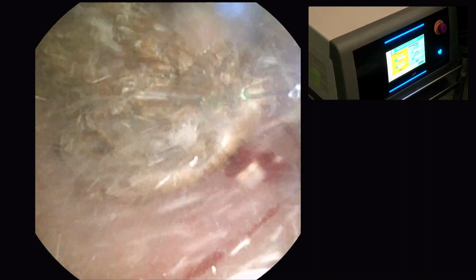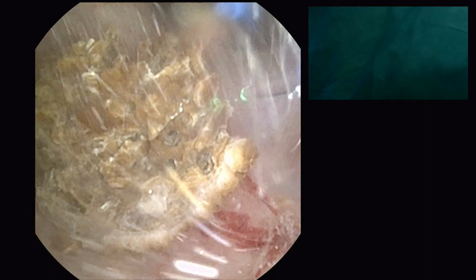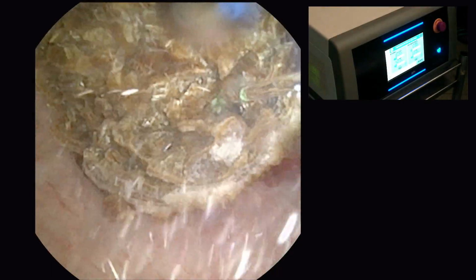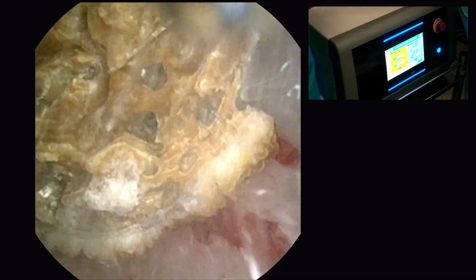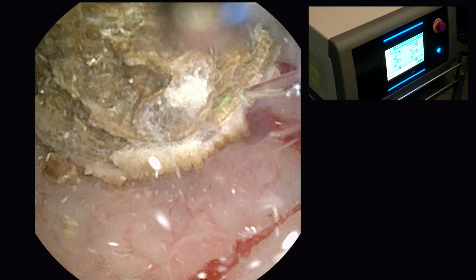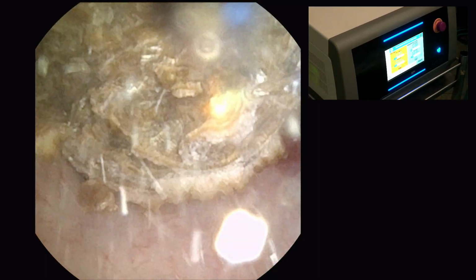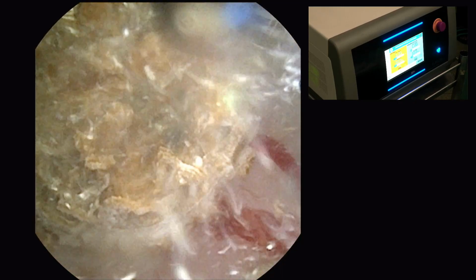So in those cases, before removing the stent, you first put a guide wire, so you are in the ureter, otherwise you will lose the track. We have seen it with many patients. So this is the experience we are getting, and that is the way to go forward.